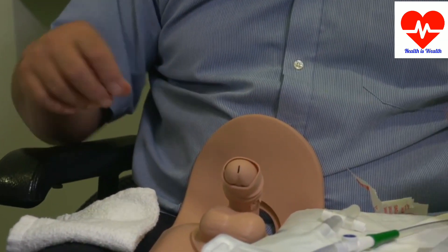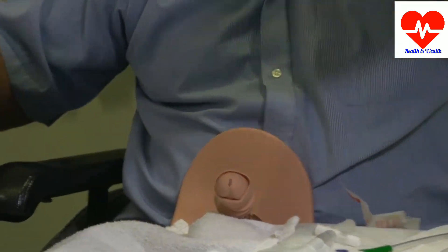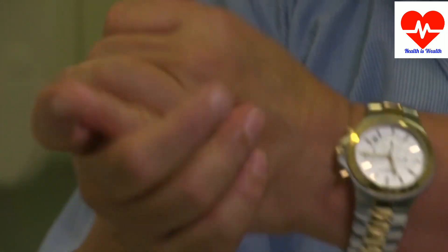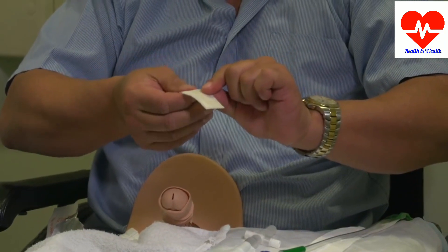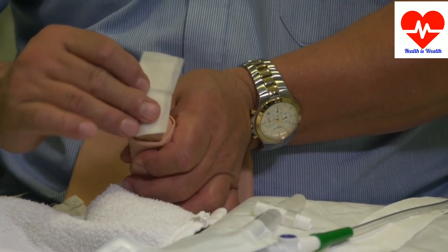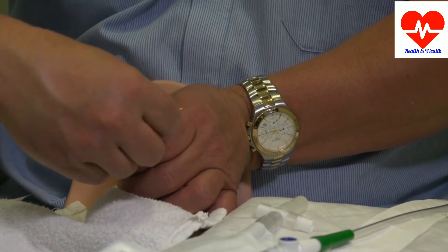For the purposes of this demonstration we are going to use a penile model. After setting up, wipe everything including placing a field underneath the penis, then wash your hands, concentrating on the thumb and index finger and rubbing until it's dry. Then pick up your sterile wipe ensuring that you don't touch anything else. Open it up. Use one surface, one wipe, one direction — south. Another surface, another direction — north. Then east and west, and discard.